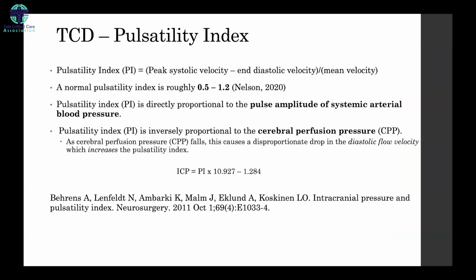Now coming to the transcranial Doppler, recently transcranial Doppler has become very popular in terms of diagnosing not only vasospasm, but also to screen for increase in intracranial pressure, to look for the cerebrovasomotor reserve, and to look at whether the autoregulation is intact or not. So we'll use the pulsatility index to know if there is increase in the intracranial pressure. Usually the pulsatility index is calculated as the peak middle cerebral artery systolic velocity minus the end diastolic velocity, whole divided by the mean velocity.